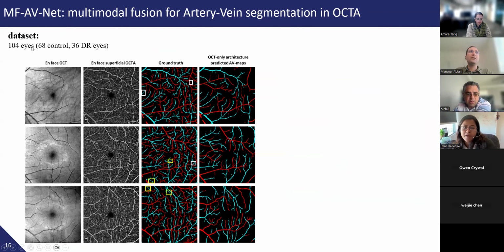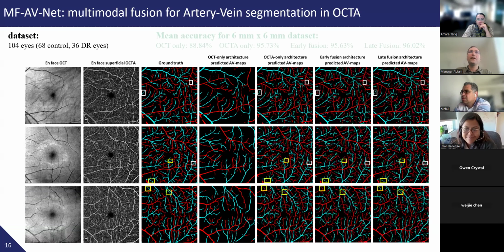Yeah, we had this data set, we had 68 control subjects and 36 DRs, but during the training, we oversampled the DRs to have a better performance on these cohorts. Got it. Because it's a very time-consuming task, that's why I asked how did you create the ground truth. Yeah, this is the most important and time-consuming part of the project.